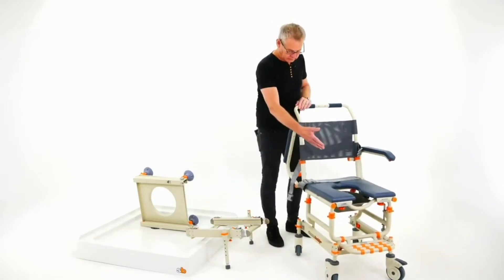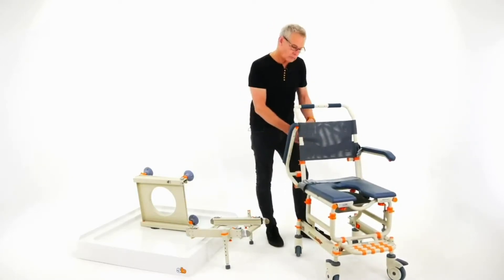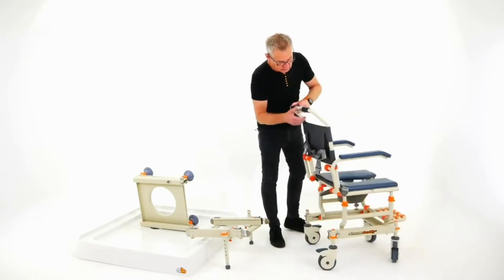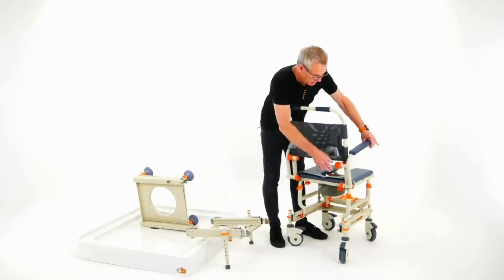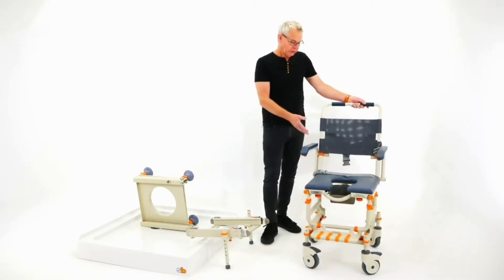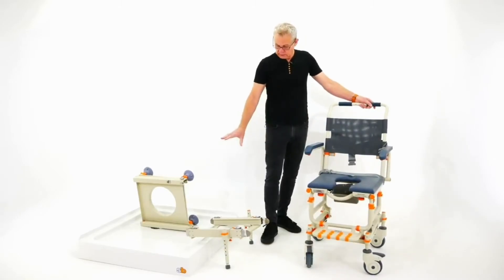Side transfer for the user — arms that clip in and are lockable. Once they've been over the toilet, then they would go into the shower.